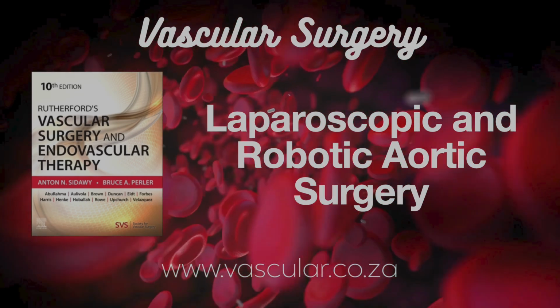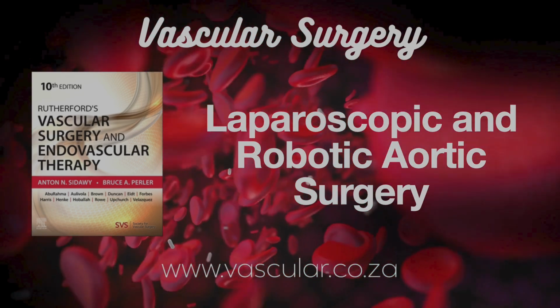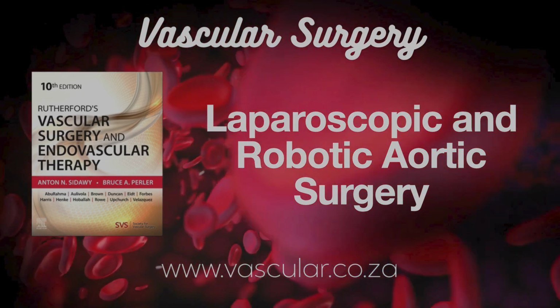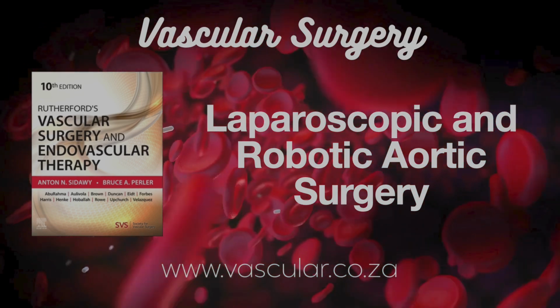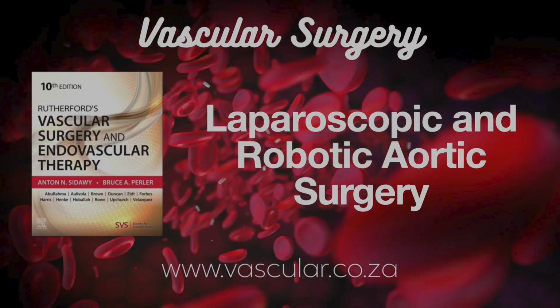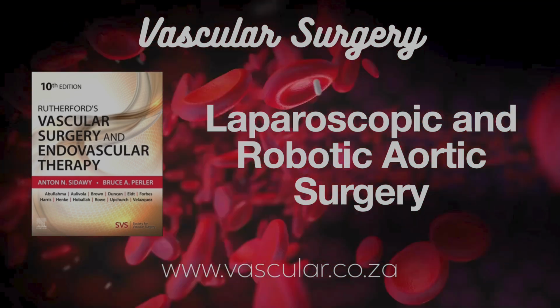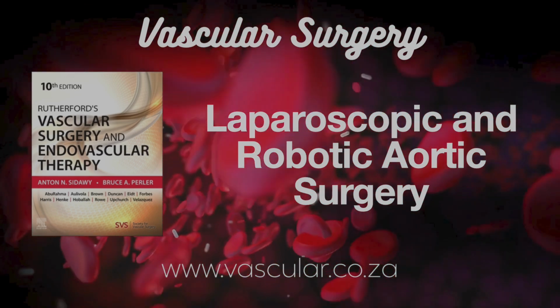It really can. And often the book says the main connection, the proximal anastomosis to the aorta, is done under direct vision through that hand port incision, using regular instruments. Ah, so sewing directly, not just with long tools for that bit. Often, yeah. So HALS helps get around some of the toughest parts of pure laparoscopy, especially the sewing.